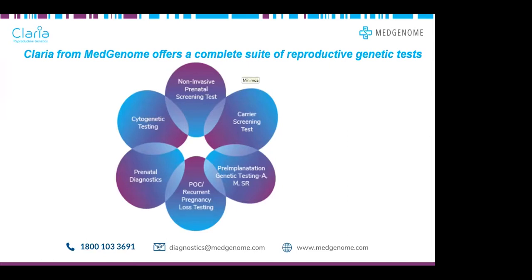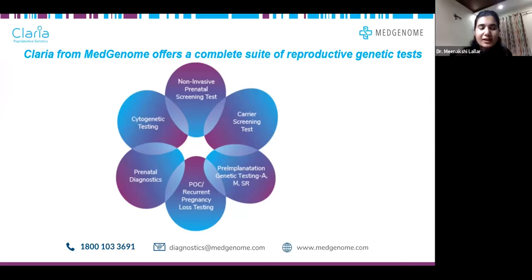Like in this case, the cavum septum pellucidum was absent. So would it be better if the patient goes for termination and then she could go for postmortem, and this could be much cheaper than the amnio and all that? From the practical aspect, that is what I said, because it was agenesis of corpus callosum, and when there is ACC, we cannot rule out mild learning disabilities, even if we don't get anything on the genetic analysis.